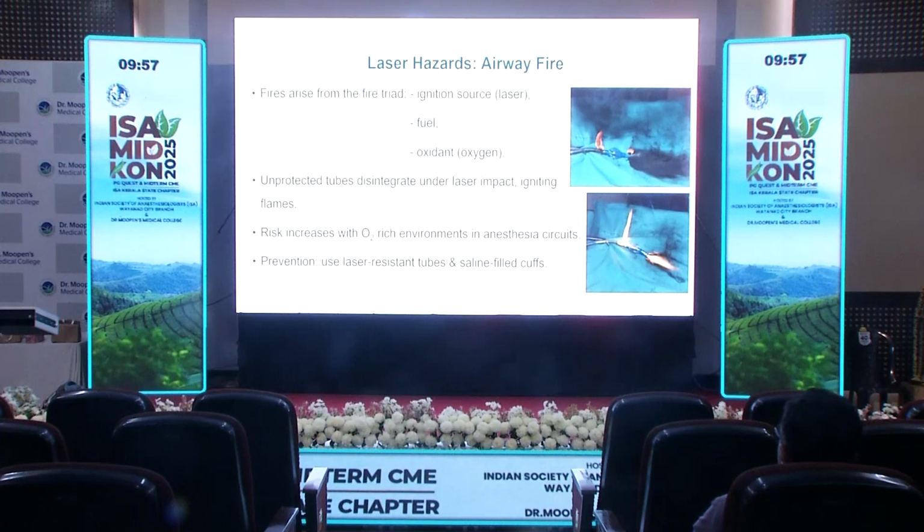The most dreaded laser hazard is the airway fire. For an airway fire to arise, it should fulfill the fire triad. That is the ignition source, that's the laser. Fuel is usually our endotracheal tube or a gauze piece, something like that, and the oxidant, that is oxygen. Usually unprotected tubes disintegrate under laser impact, igniting flames, and the risk increases with oxygen-rich environments in anesthesia circuits, and the prevention is with the use of laser-resistant tubes and saline-filled cuffs.